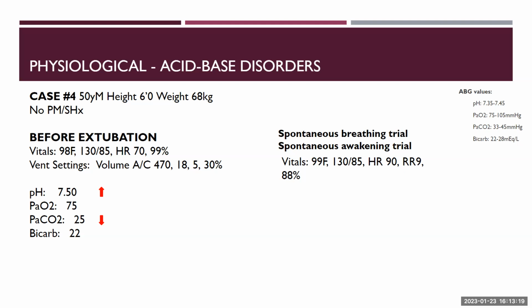Sure. I don't remember exactly if I saw SBT, but the attending did ask me, there are like three different criteria that you check to see if they're ready to be extubated. And then I guess before doing the extubation we can turn off the ventilator for a bit to see if they're breathing on their own. And then I'm sure we check something else, and if they pass that we take it off, but I don't remember the specifics, I'm sorry. All right, it's the blueprint. That's a good start.